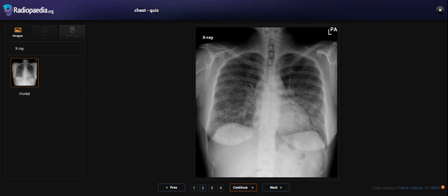What we see here is bilateral reticular opacity with ground glass opacity.